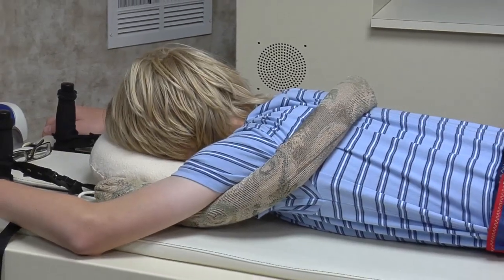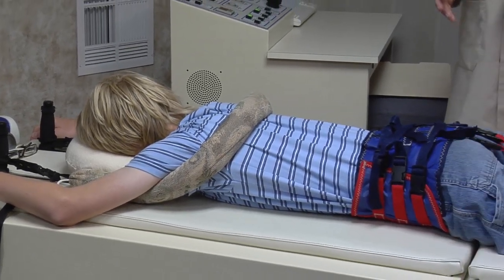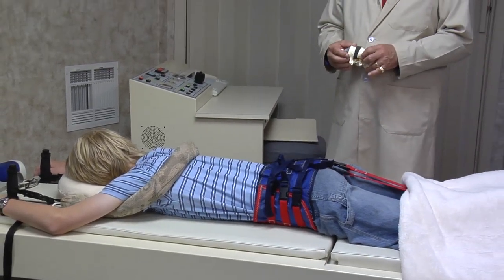When we've tried different forms of manipulation with chronic and severe disc cases and they fail to respond to our satisfaction, one step before surgery is using the VAX-D program of intensive care, which is a 24-visit program of daily treatment. 90 to 95 percent of the time, we can prevent back surgery using this program, especially if we combine it with manipulation and hydrotherapy.